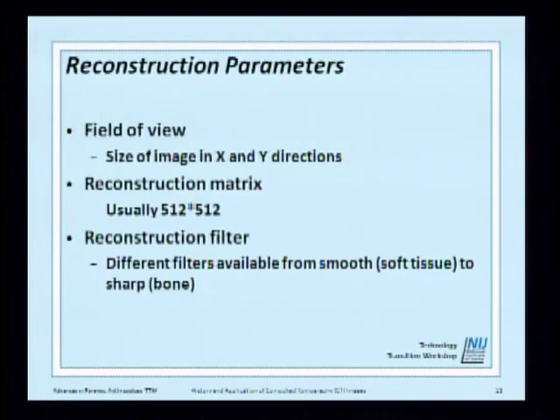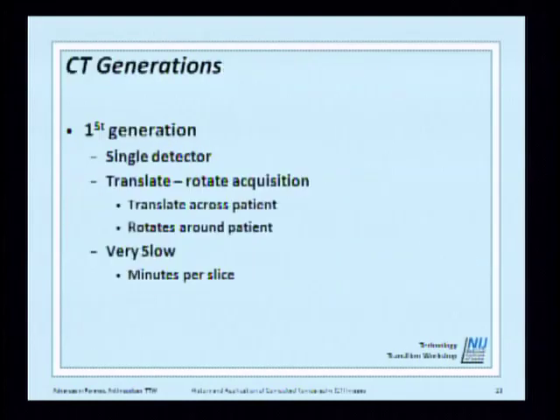Now, this creates different configurations, and this is very general, but some manufacturers don't work the same. I tried to replicate from GE with Siemens, and I had some trouble because of the milliampere. They have different values, so I'm going to say later how we solve this problem.